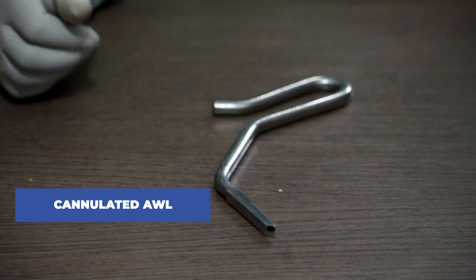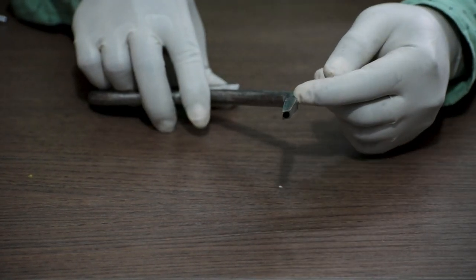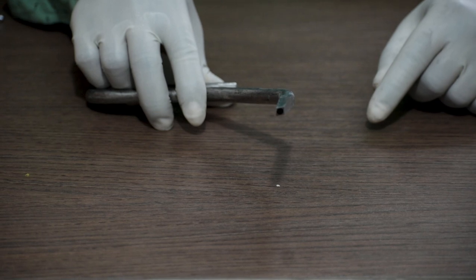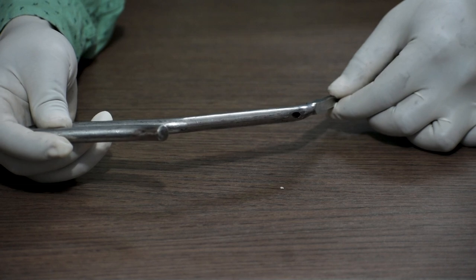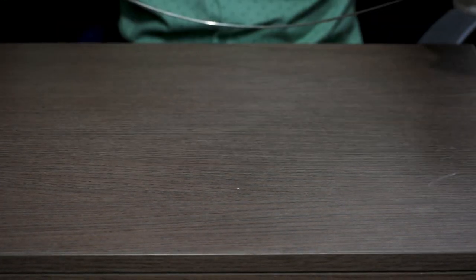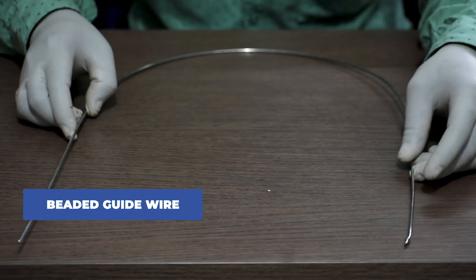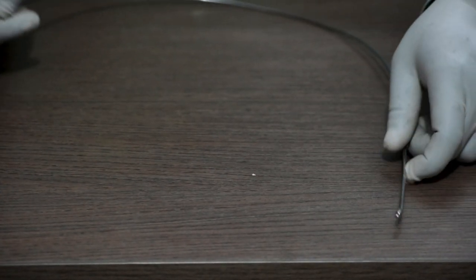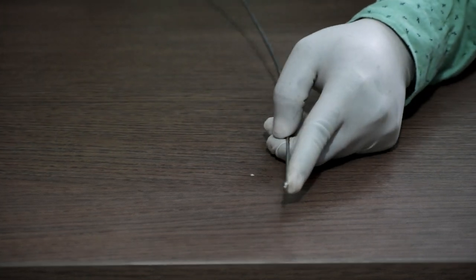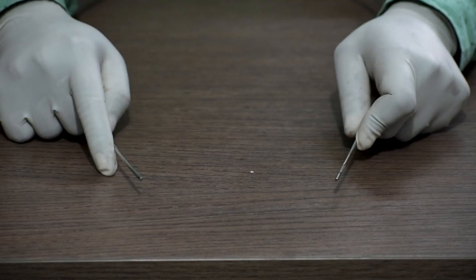This one is a cannulated awl. As you can see, this is cannulated, so a guide wire can be passed through it, making it easier for the guide wire to pass through. Next is the beaded guide wire — it's a long guide wire. Next is the normal or plain guide wire; as you can see, there is no beaded region for this guide wire.